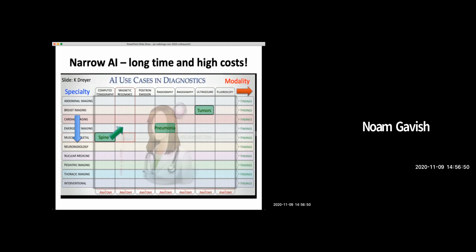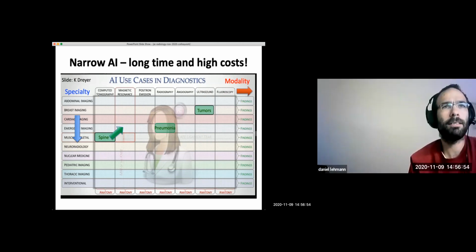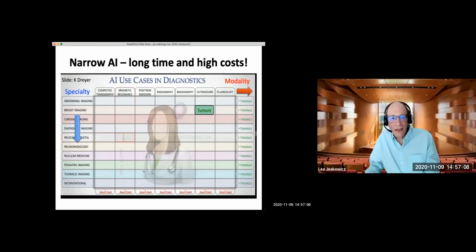Thanks. More questions? Can't we collect the data during normal treatment? As in, radiologists do their work. Can't we collect the data when they do their normal work? Why do we have to collect the data? Because you don't have the delineation.